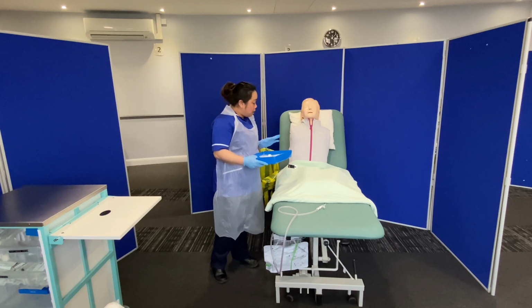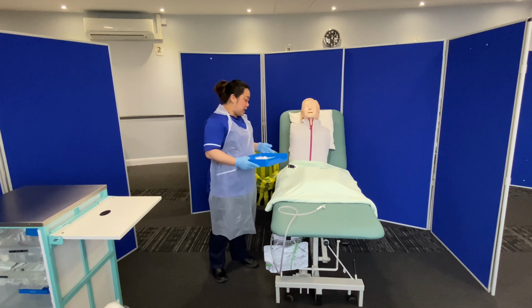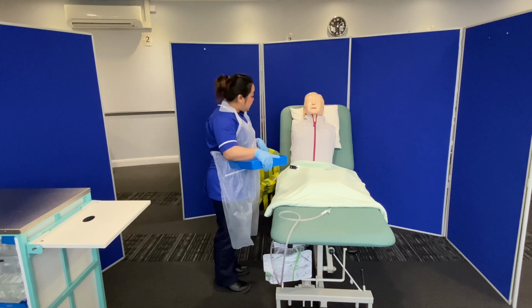I'm happy that this is Lindsay Lohan and I'm going to perform the CSU at your bedside. Right, Lindsay, so I can confirm that I'm with the correct patient. Do you have any allergies that you are aware of? None that I know of. Perfect. So I'm going to proceed.